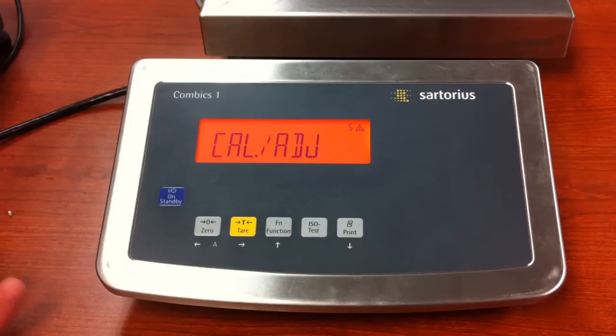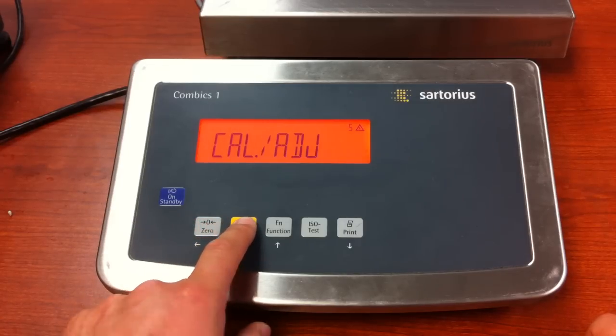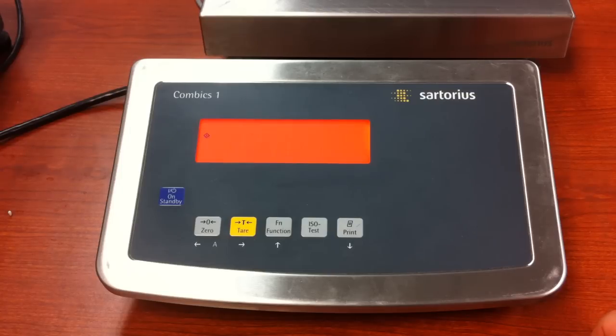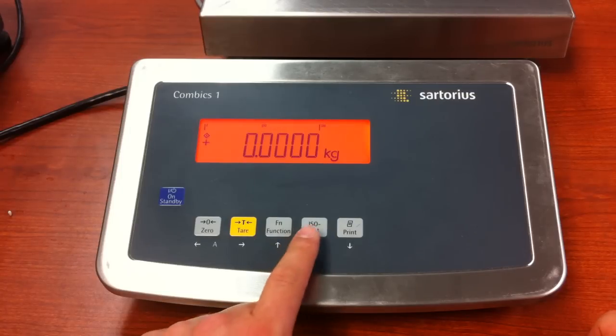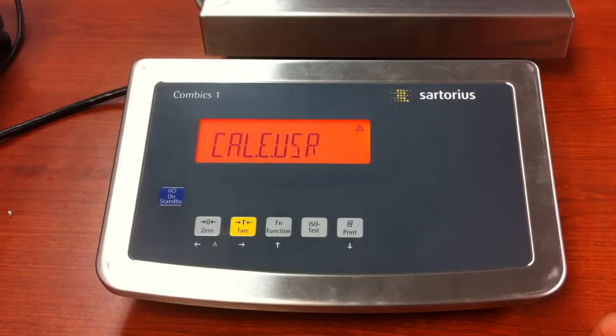If you do not get an INF 71, that means the value was accepted. Once you have it in place, you can press and hold the tear key. The unit will reset. And now, when we go to calibrate, press and release the ISO test key. You will see that the unit now has the calibration value that you selected.